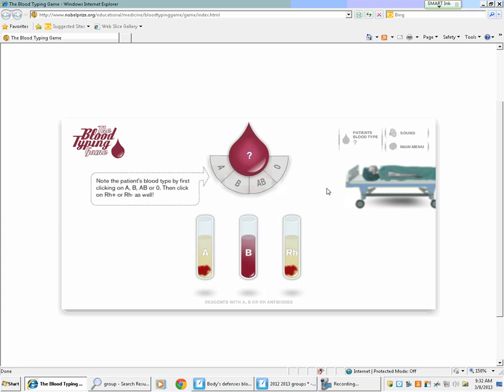Doctor in training, someone please tell me. Dr. Borky? It clumped. Therefore, what can we say, Dr. Taylor? Agglutination. Therefore, what can we say? So we're saying what about this blood? You're saying it's RH positive. That would be a conclusion or a hypothesis that you can come up with.